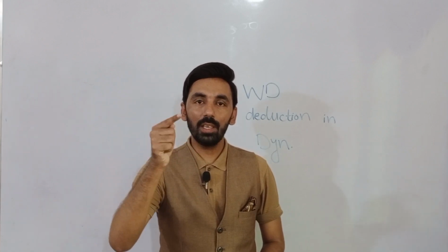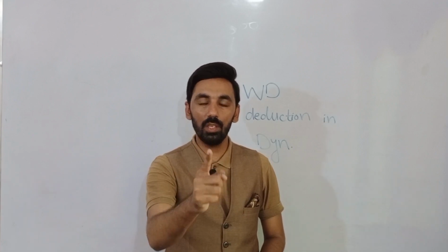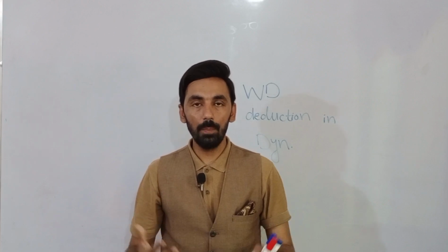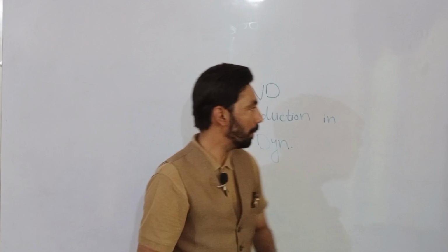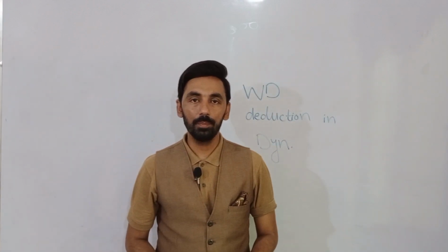To find the correct prescription of our glasses, we have to deduct this working distance from the neutral points, so we can get the best corrected prescription. I hope this is clear. So now we will start the procedure of Sheard's method.